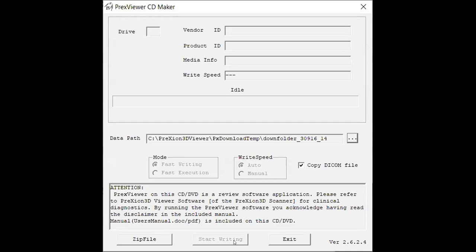I'm currently working out of my laptop without a disk drive available and therefore you'll notice that my second option there, start writing, is currently grayed out. But if you do have a disk drive you'll want to insert the disk first and then you'll want to select start writing.